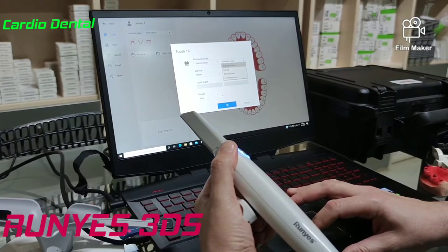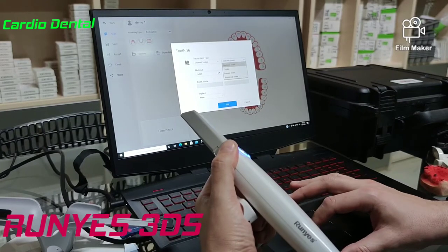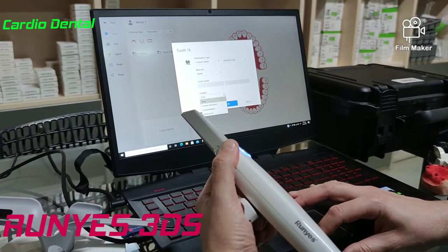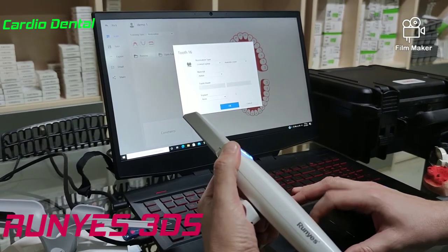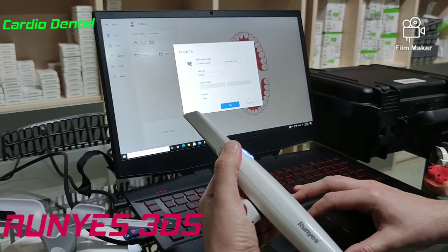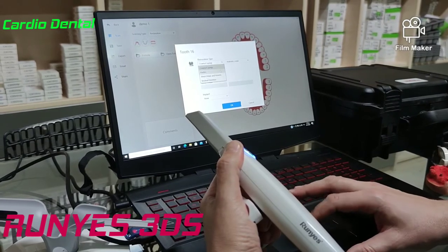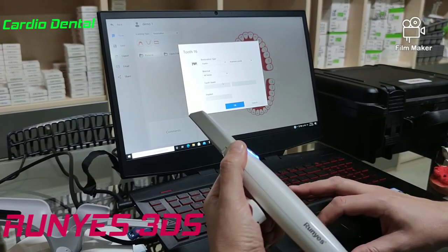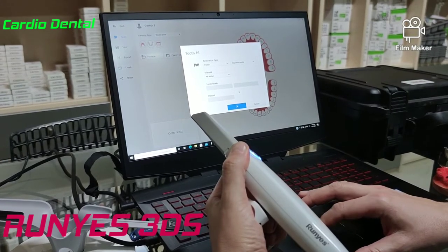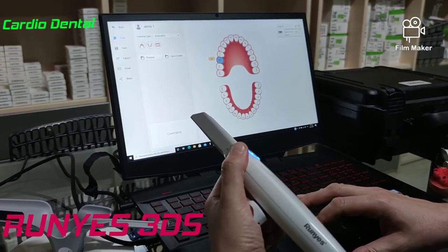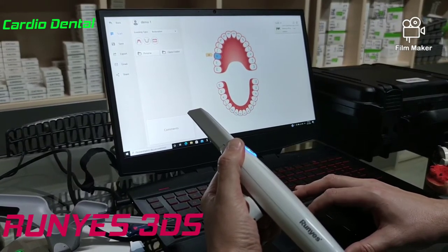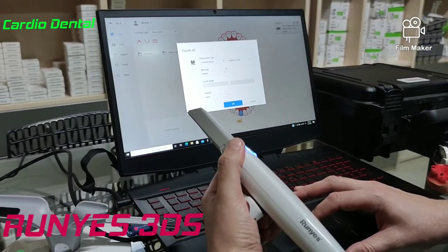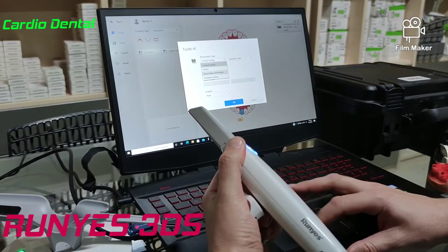We select what type of crown we would like to have, what kind of material, tooth shade, and if there is any implant. For example, let's say an anatomic pontic in metal, and we can select the shade. You can see here what we have selected. We can do this for all the teeth that will be in the plan.